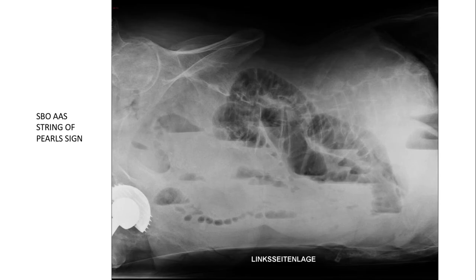We will know now how we differentiate small bowel from large bowel. Okay, this is called SBO, small bowel obstruction, AAS, acute abdominal series. This is the string of pearls sign. We all know how a pearl necklace or a string of pearls looks like. It will look something like this, you see? It's like beads that are interrupted at a certain point that form a string pattern. This is a sign on a radiograph indicating small bowel obstruction.